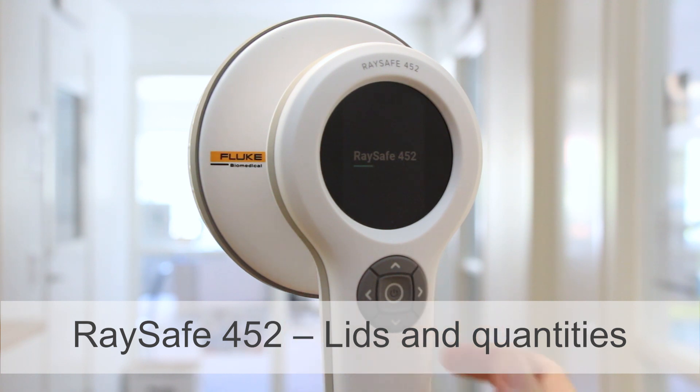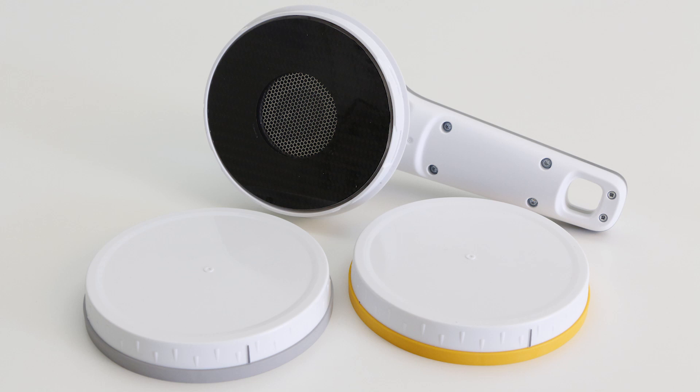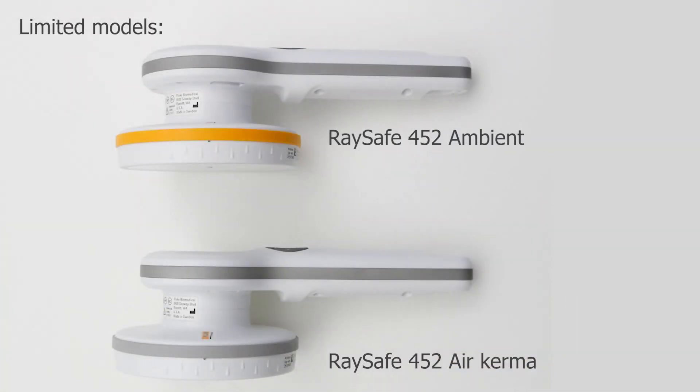In this video I'll show you the lids and the measurement quantities of the Raysafe 452. The Raysafe 452 comes with two lids: the AirKerma lid is gray and the ambient lid is yellow. Just a note before we start — the limited models called Raysafe 452 Ambient and Raysafe 452 AirKerma can only measure with the lid mounted.